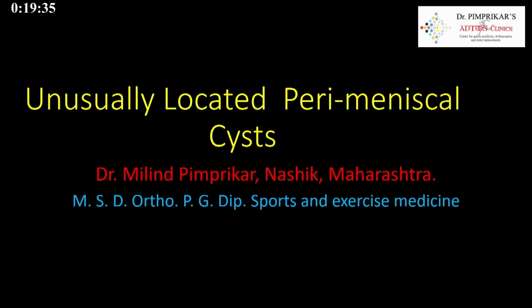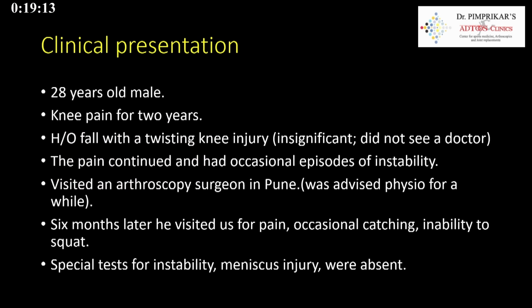We know that perimeniscal cysts are in communication with the joint cavity, and the cyst fluid is in continuation with the joint, and hence you need to repair the meniscus as well as the capsular rent. So I'm going to present three cases, a very short presentation and more technique based. He's a 28-year-old male with knee pain for the last 2 years.